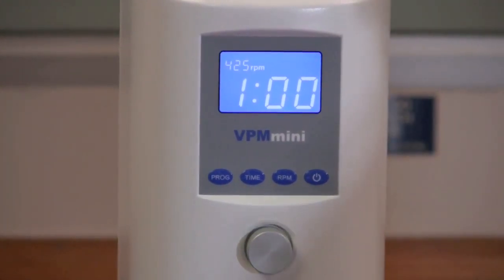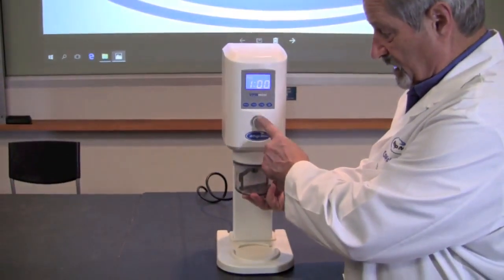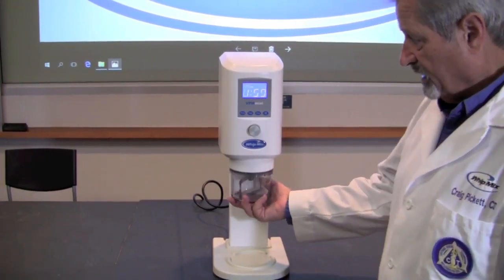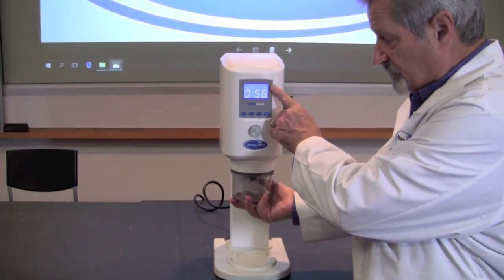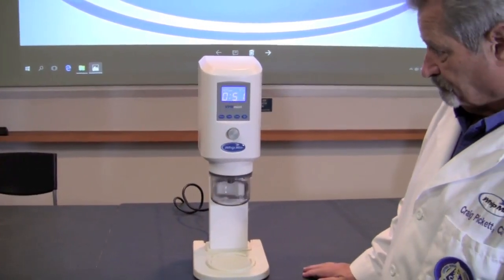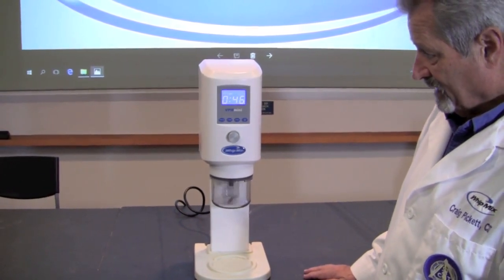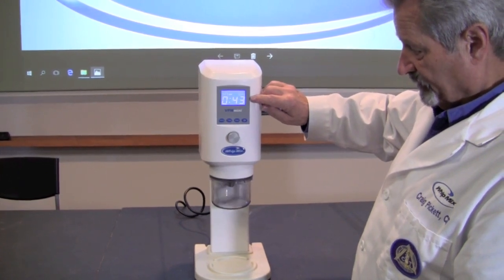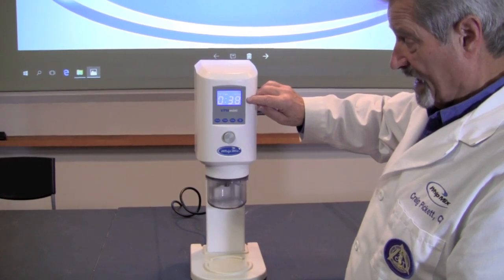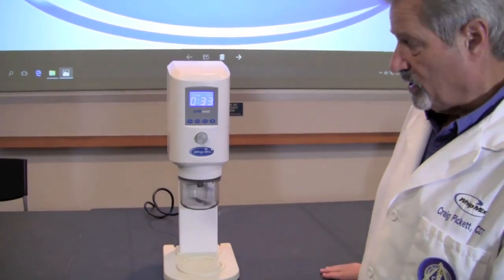So if we were to use that particular program, we would place the bowl in place up in the throat and press the big silver button in the center to start the program. On the right-hand side it will tell you how much vacuum is being pulled. It will hold the bowl and begin the program, and it will count down the amount of time for the program to come to an end. You'll be able to see this while you're doing other things in the laboratory or office.